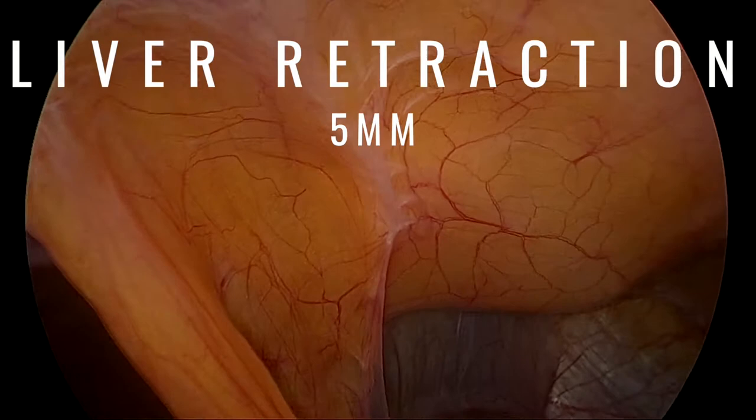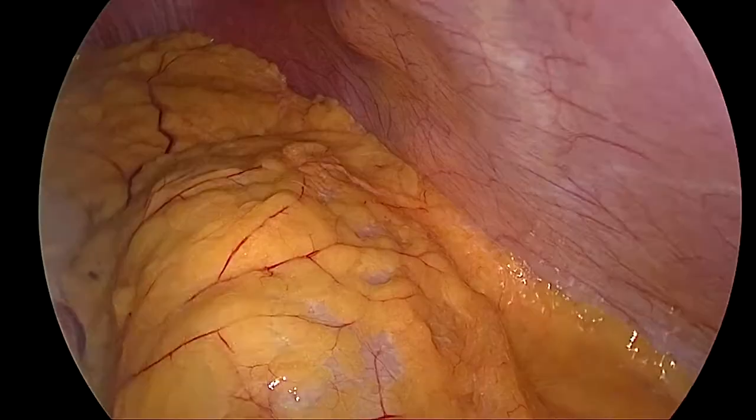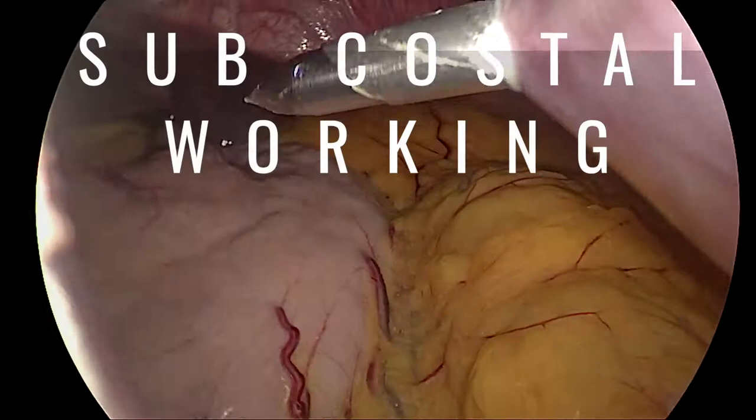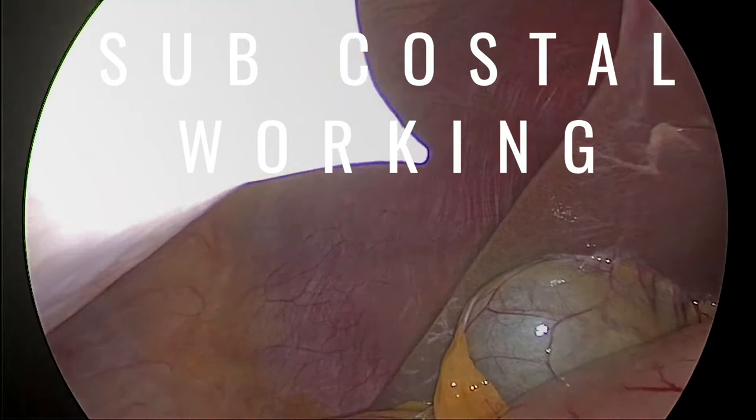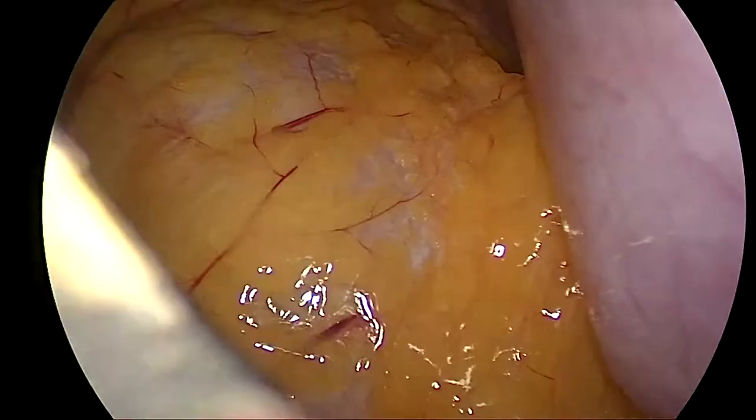The next port we use is the liver retraction port. It is 2 to 3 centimeters above the lower border of the liver, so that when you lift the liver, you use the body of the instrument, not the tip of the instrument. The next is the left subcostal port, 2 cm below the costal margin. This is the right subcostal port. If the falciform ligament is a large one, you can go through the falciform ligament and you can keep the trocar across the falciform ligament.